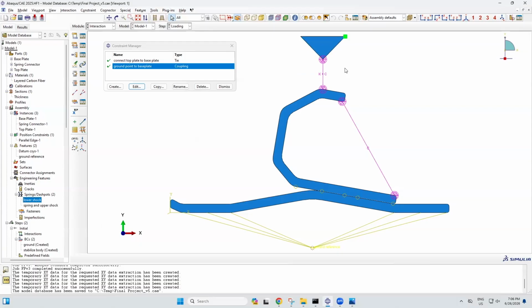So what you're really looking for is a dampener that will allow deformations slightly larger than what would be expected at equilibrium, but will then return to equilibrium without multiple oscillations. It will only be one oscillation.